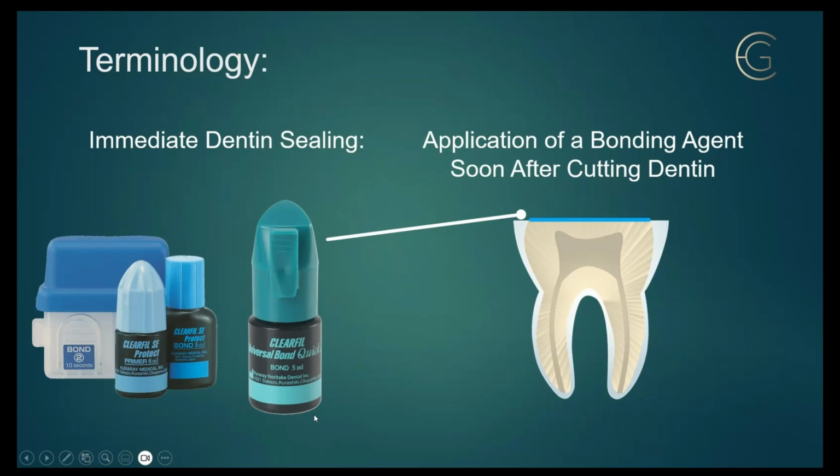Also, you need to know the pH of your product. This one can be self-etch, selective etch, or total etch. It works really well with a self-etch because its pH is 2.3. If you're using Scotchbond Universal, you need to be doing a total etch at all times.